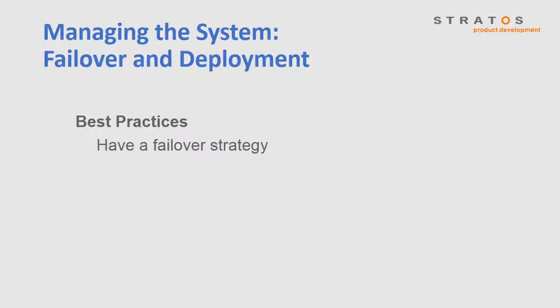Since IaaS hardware is broadly distributed across geographical areas, most IaaS and PaaS providers offer services that detect failures in one region and redirect traffic to another. These are sometimes called DNS failover solutions, and they're crucial to a highly available system. Since there's no failover strategy for this connected patient monitoring system, what can be done to address the system outage? Four months after release, the development team is no longer available.